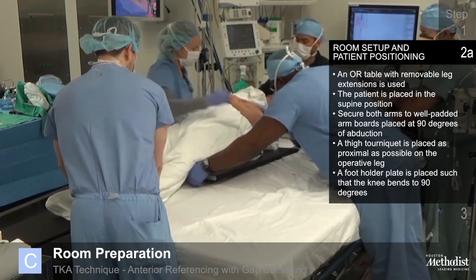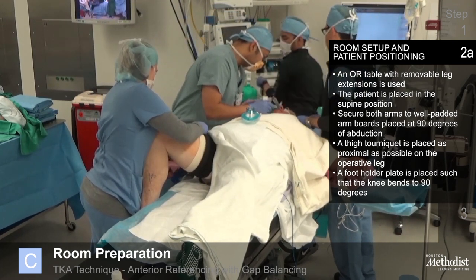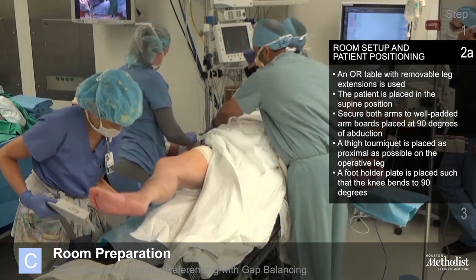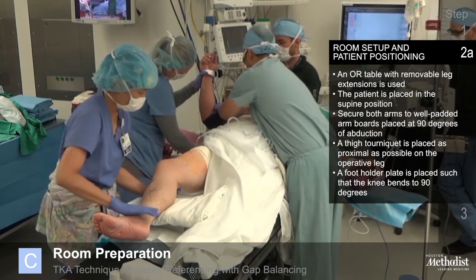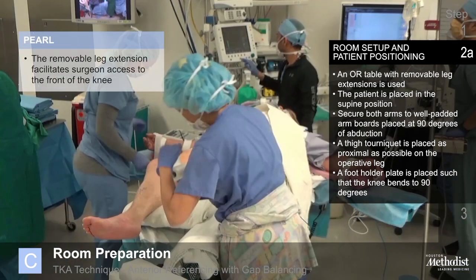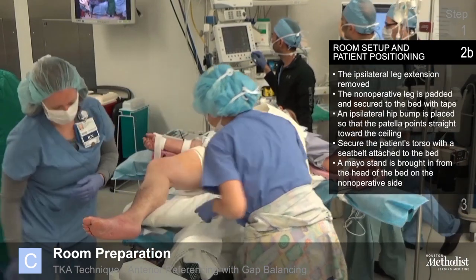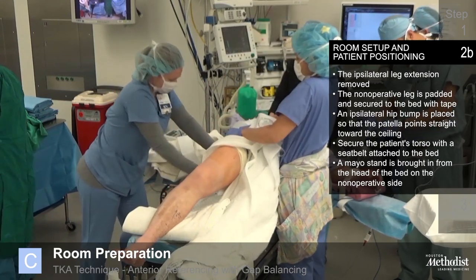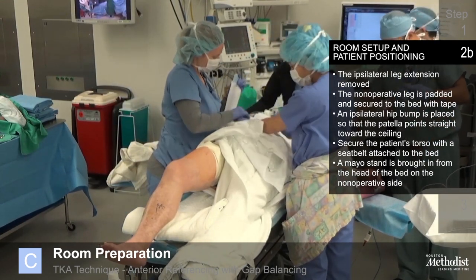The patient is placed in the supine position. A thigh tourniquet is placed as proximal as possible on the operative leg. Both arms are secured to well-padded arm boards placed at 90 degrees of abduction. A foot holder plate is placed such that the knee bends to 90 degrees of flexion. The ipsilateral leg extension is removed. The non-operative leg is padded and secured to the bed with tape. An ipsilateral hip bump is placed so that the patella points straight toward the ceiling. Secure the patient's torso with a seat belt attached to the bed.